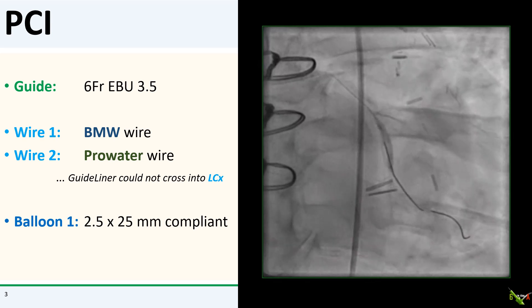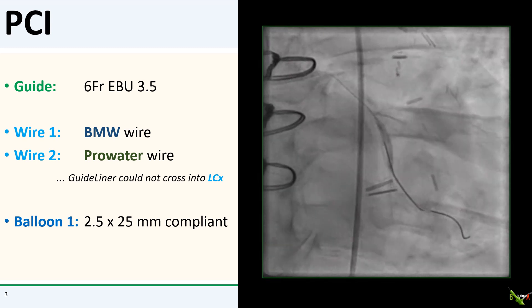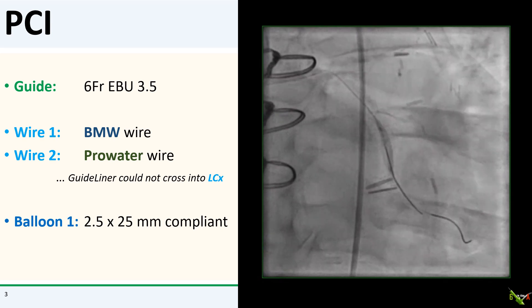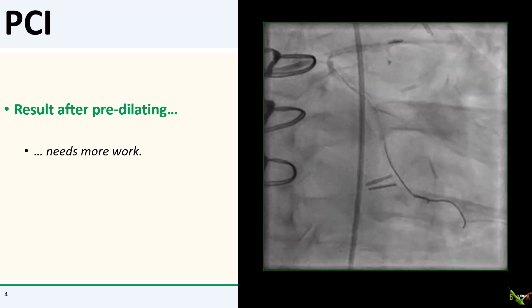So I passed a second wire into the circumflex as a buddy wire, and with the buddy wire in place, I was able to get a 2.5 by 25 mm compliant balloon to cross. That balloon actually inflated fairly well, as you can see here. So I dilated the whole circumflex and left main, and here is what we now have — it still needs a bit more work.